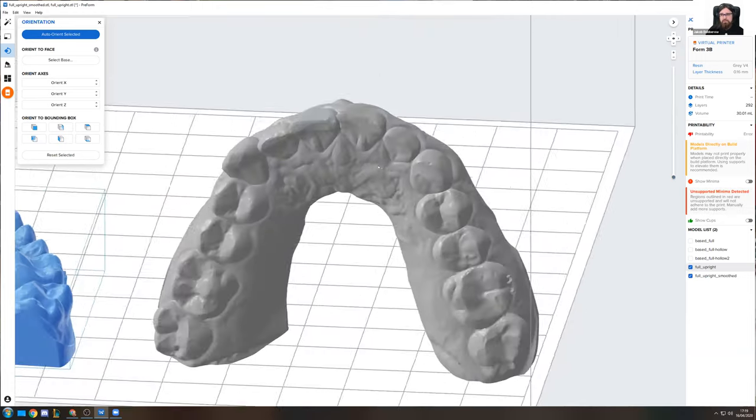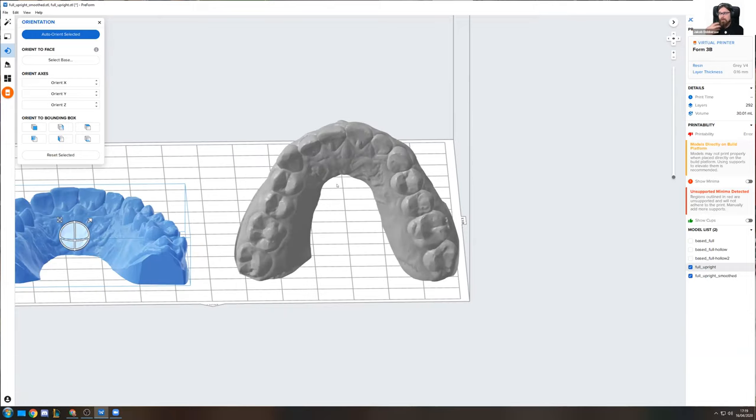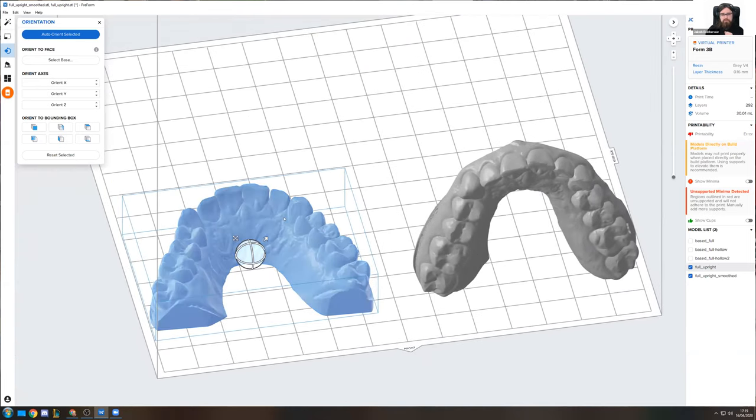But this is basically a very easy way of helping your printing process and not using as many supports, while at the same time doing a little bit of an extra thing before you even put the models into Preform. And this is generally how you would be using the software. There, as you can see, there isn't really a whole lot to this.